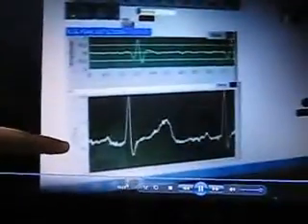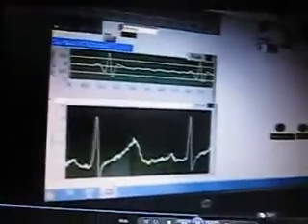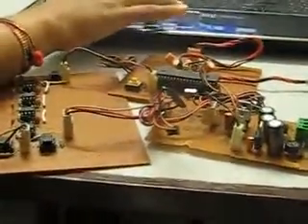After filtering the signals in LabVIEW using the 30 order Butterworth filter, we are getting the patient signals with this much clarity. Right now we are not getting the diseased patient, so we are taking the ECG of a normal person.